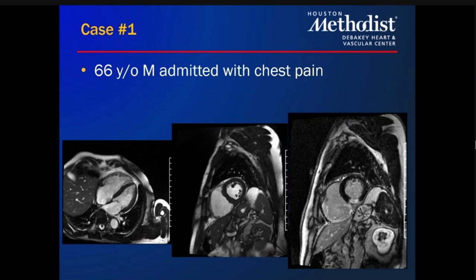I'm sorry, and then the LGE, looking at it again, the RV has LGE all the way as well. So the inferior, and then the lateral wall also, the bottom lateral, I should say, on the image. And then the RV looks bigger than the LV, at least on the four chamber, with some decreased function. Thickened mitral valve, at least. And then tricuspid, there's TR for sure, and the RA is big. So George, what do you think happened to this patient?